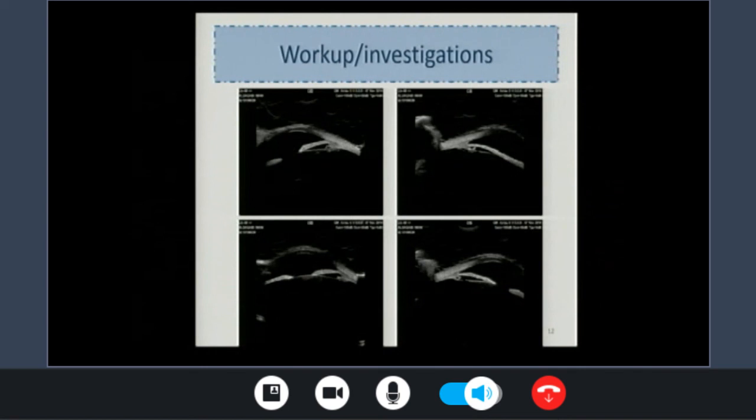So we also sent her for UBM, and when she came back, the report of the ultrasonographer was that it is negative for angle recession. However, looking at the photo, you can see that, similar to what Dr. Faisal explained to us earlier today, there is a widely exposed ciliary body, and the iris insertion is pushed posteriorly, so here it is evident that we have angle recession.